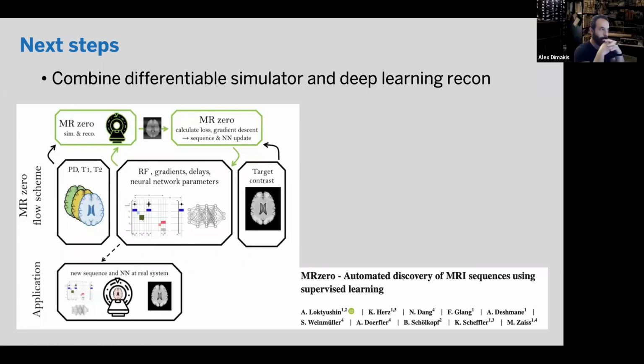Right. I see. I don't think that with those works, to be honest, it's not clear to me if it's actually improved over having a fixed sampling yet. Although one thing to note is that everything we're doing right now is in the simplest possible setting where we have 2D images and we're choosing essentially out of 256 numbers, let's choose a subset of them, right? Which integers to sample. And the MR system is way more complicated than that, right?